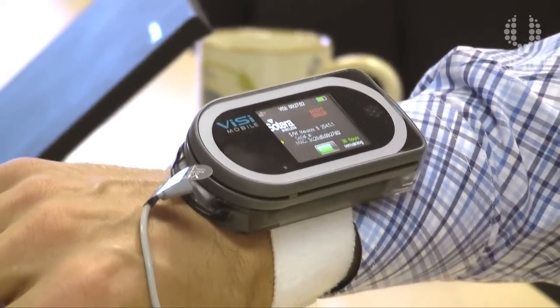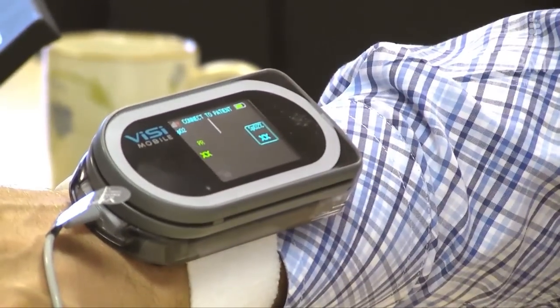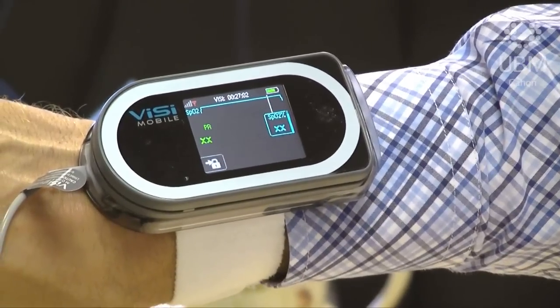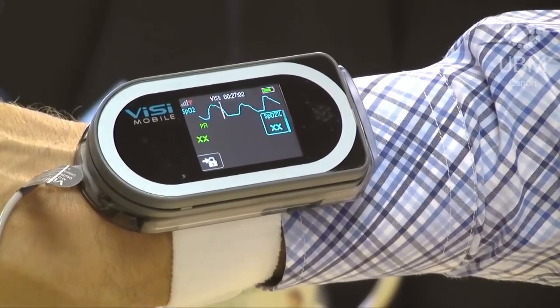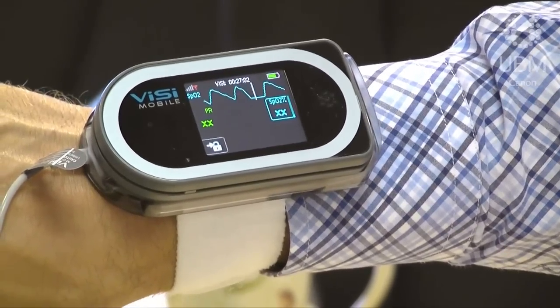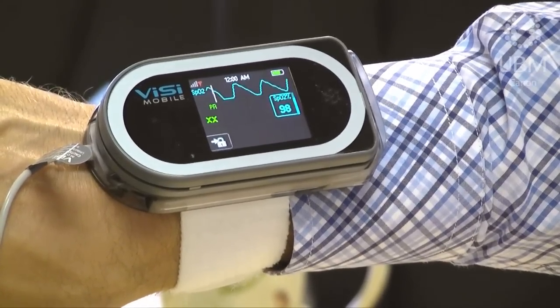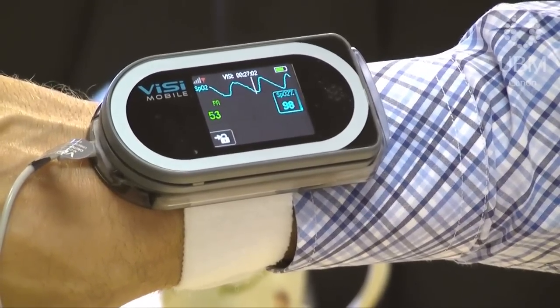The device goes through a couple of technical checks, fires up, and after a few seconds it starts reading my SpO2 and pulse rate — so now the monitor is alive. You can see the plethysmogram as it develops, and after a few seconds of averaging it shows first my blood oxygen saturation — the SpO2 — and then a few seconds after that, my pulse rate as well. That's the most basic form of monitoring: SpO2 and pulse rate.